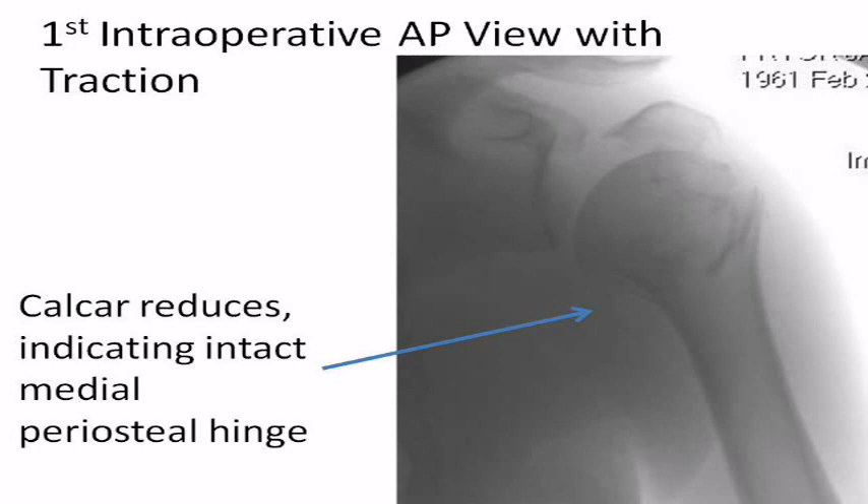A true AP x-ray is first obtained with traction to visualize the behavior of the humeral head. In this case, the humeral calcar reduced near anatomically, indicating that the medial periosteal hinge of capsule and soft tissue is likely to be intact. This also improves the prognosis regarding vascular supply to the humeral head. The humeral head is still in valgus, however, with the superiorly displaced greater tuberosity — this is what has to be reduced before fixing the fracture with the nail.